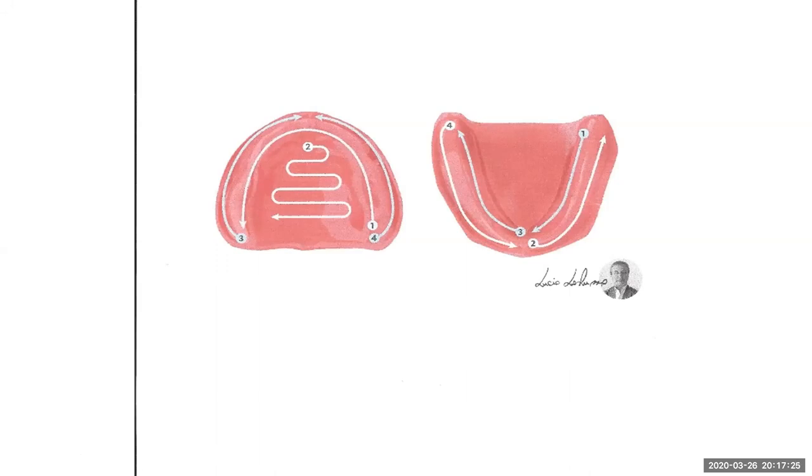And even on the lower, you can see how everything was scanned. He goes in the direction where he captures everything he needs to capture, and he's been very successful with that. So some people are successful. The cases I've seen with intraoral scanning, fully edentulous cases, have not been that accurate. I think we're getting there. It's probably going to be shortly, but we're getting there. One of the things we do get is a lot of intraoral scanning on immediate cases, and these seem to work out well because at the time of extraction, many times the denture is relined or soft-lined.